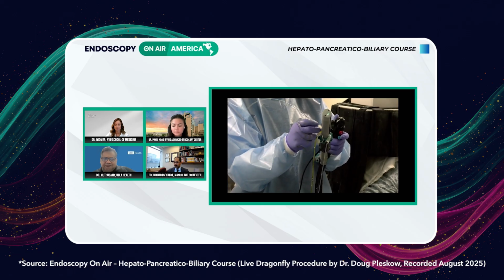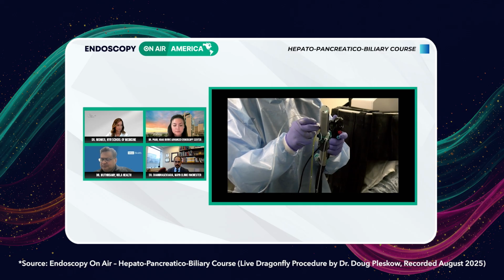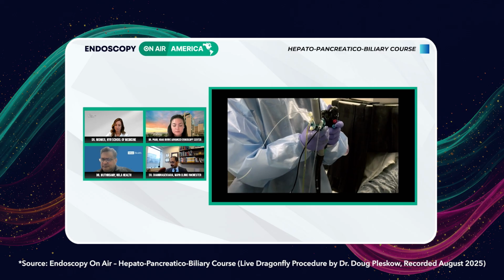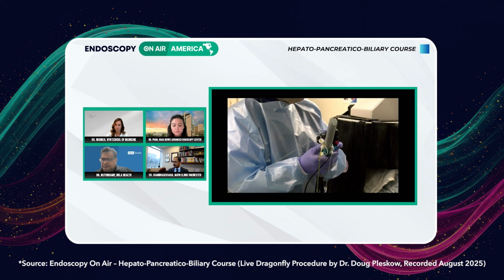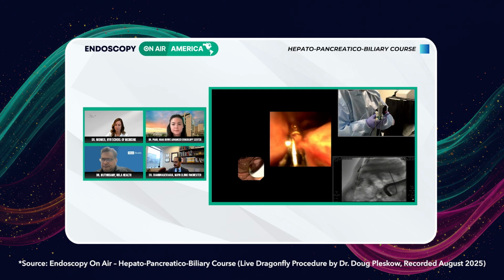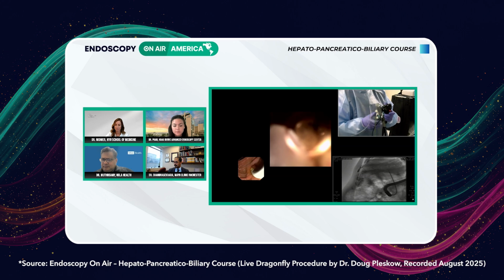It's really important to educate the pathologist, because if they're new, when we first started, sending them the little tiny pieces that we used to get with the SPY legacy system was really challenging for them to read. So I'm using forward motion to actually push that biopsy forceps pretty deep, close. And I think we're getting really nice specimens here. I feel like I'm really getting a pretty good chunk of the tissue here.